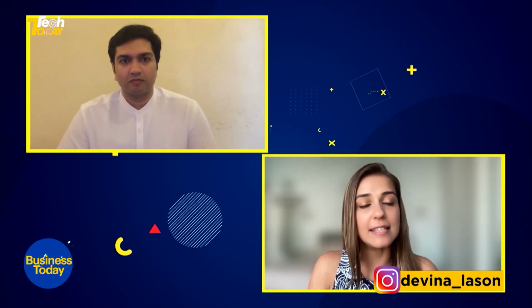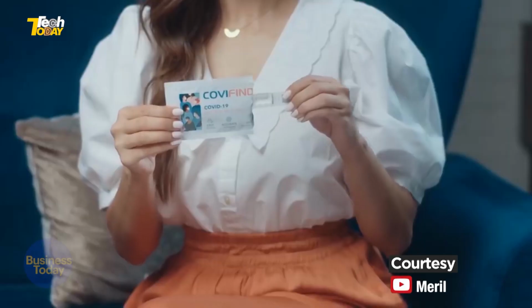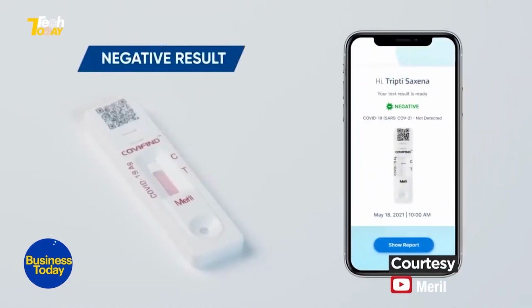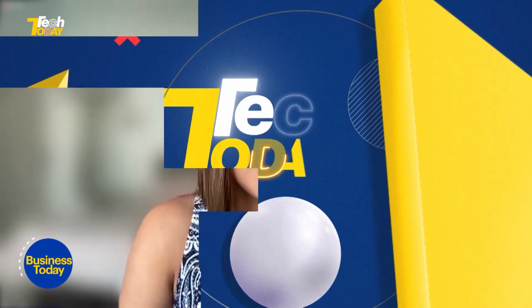Could we just start with understanding a little bit what exactly is this rapid antigen test and how does it work? Essentially, what it consists of is a plastic cassette with a paper or cardboard strip embedded in it. And on this strip is a reagent which consists of an antibody that will bind the SARS-CoV-2 antigen. So what's really the difference then between the test that you would do in a lab versus a home test?